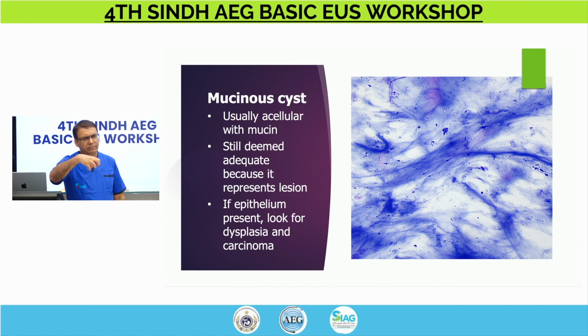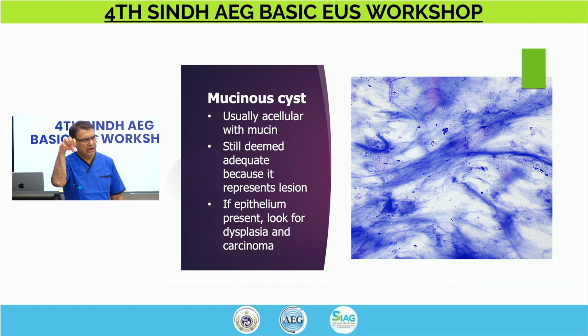I aspirate the fluid from the smaller cyst and rotate the needle. I leave that needle in when all the fluid is aspirated. I get the needle and spray it off the wall of that area. I may not see the wall, but I'll just stay there and move the needle back and forth a few times in a very small contained area, hoping to get some cells.